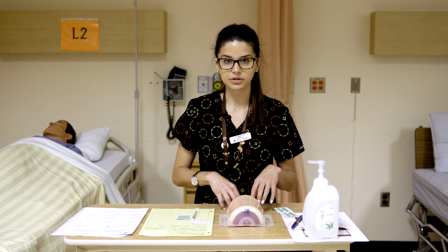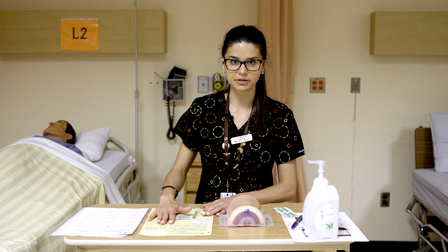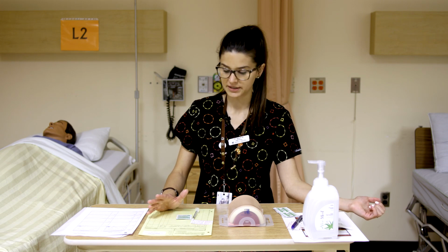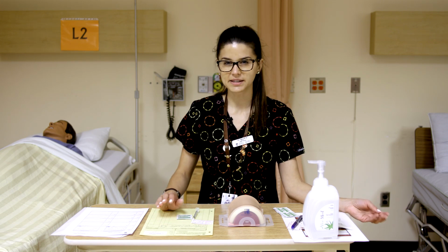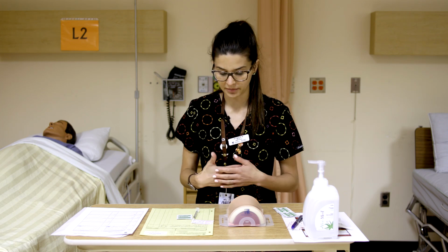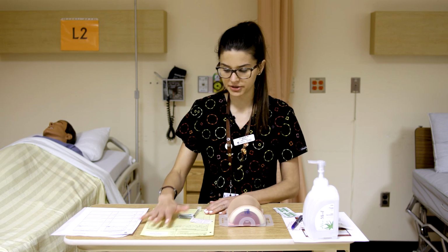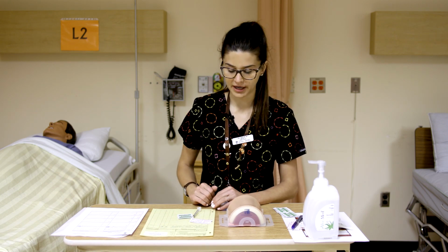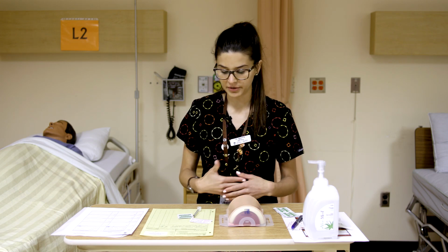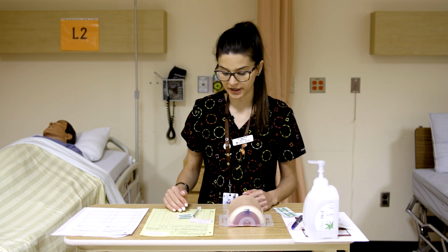And then you're going to, again, introduce yourself to the patient, talk to the patient, and explain the procedure to them, why you're doing this test, that this is a tuberculin skin test. It'll be read in 48 to 72 hours. It's an injection, so it will pinch a little bit, but it's not a deep injection. And you'll want to make sure that they don't have any allergies, so you'd want to ask them that then. And that's where you're going to check their wristband and verify their identity by speaking to them and asking them for those 2 patient identifiers.